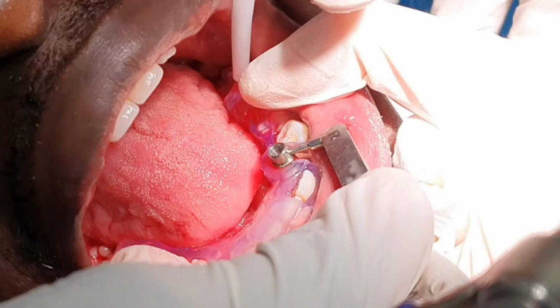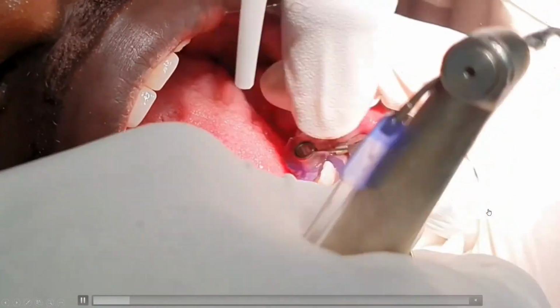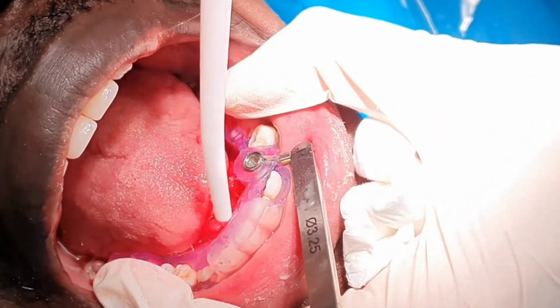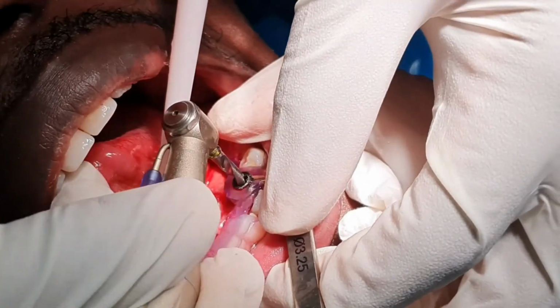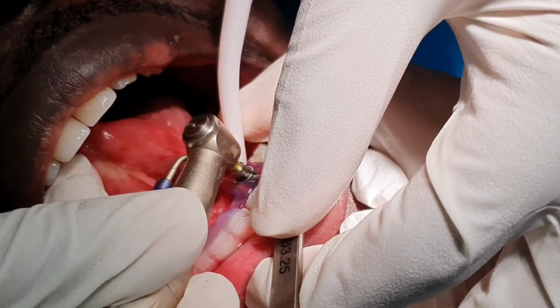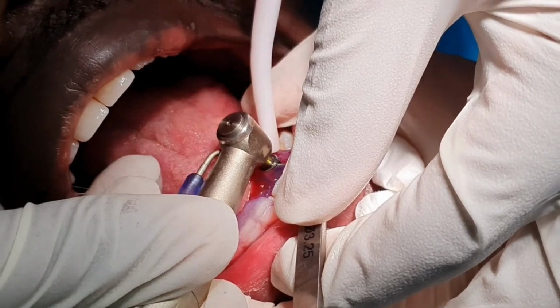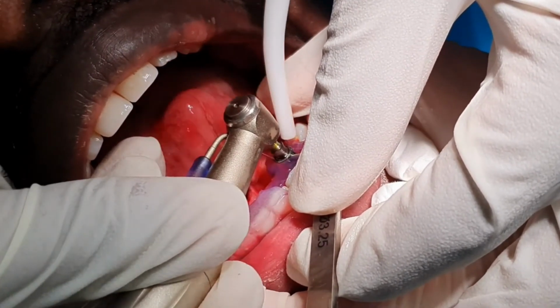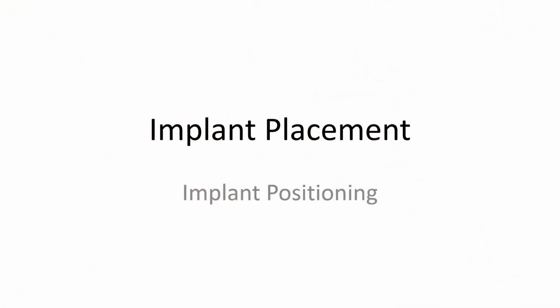And now you take the next size spoon, and obviously you position that into the patient's template. And now you take the burr, you support the other side with your free hand, position it, you're ready, start the burr going, and straight down, and you make your osteotomy like so, and make sure you see that you've gone the whole length. Don't not go to the whole length of the burr. You can't over drill because the stop will prevent that from happening.